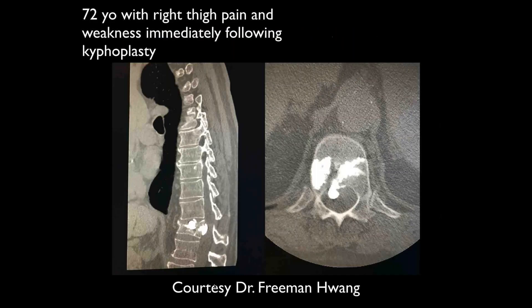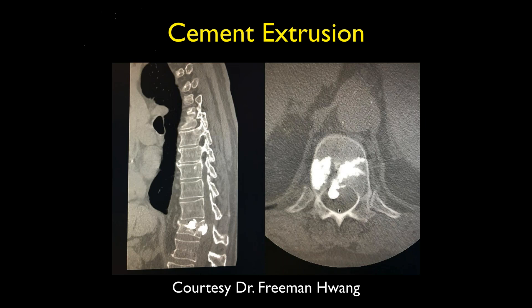Shiv: 72-year-old with right thigh pain and weakness immediately following kyphoplasty. One of the lumbar vertebral bodies — looks like T12 — was fractured and they tried repairing it with cement. It looks like the cement went posteriorly into the spinal canal. What's happened here is cement extrusion that has come back in and is compressing the conus.